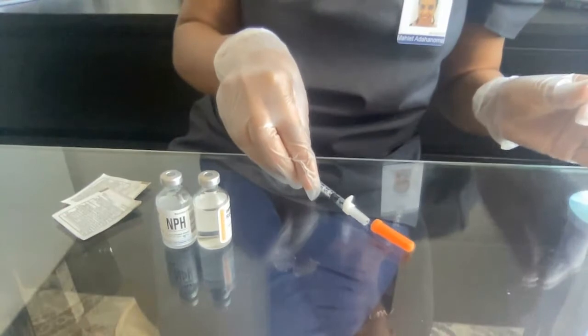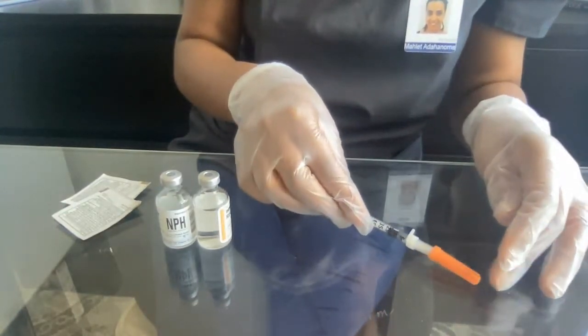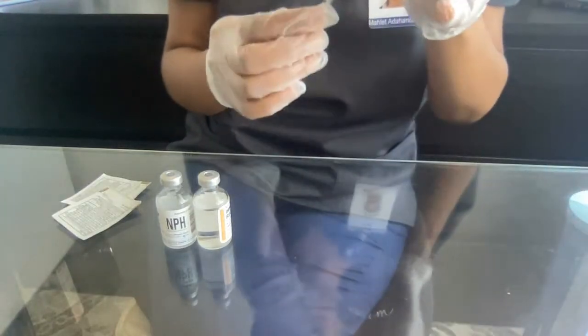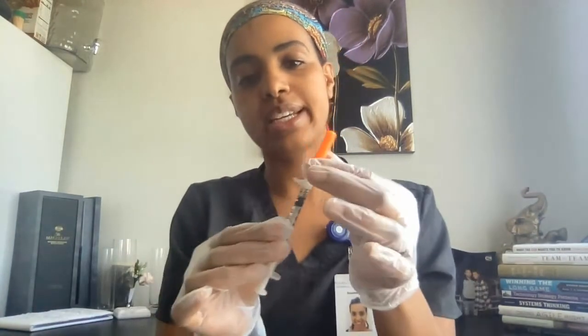So what I'm going to do is pull this cup like this and put it up. I'm going to use the scoop method because my table is kind of slippery, so it wasn't going away, but I'm going to do the scoop method and put it inside like this. And then label it, so as not to make any medication error.